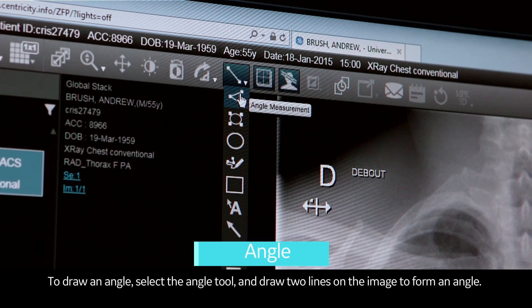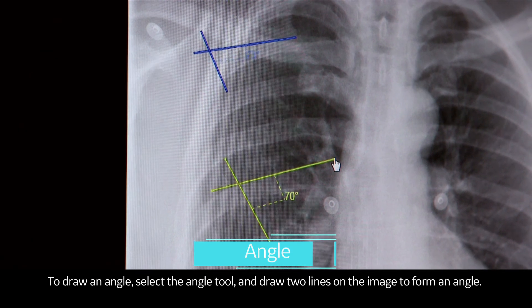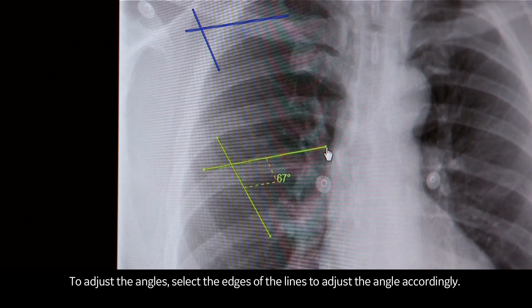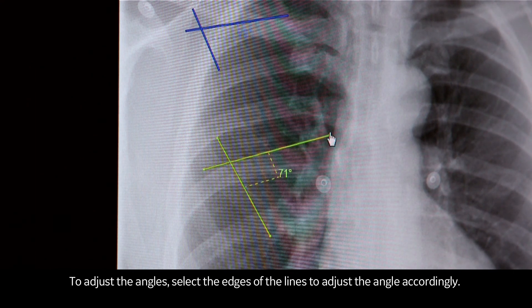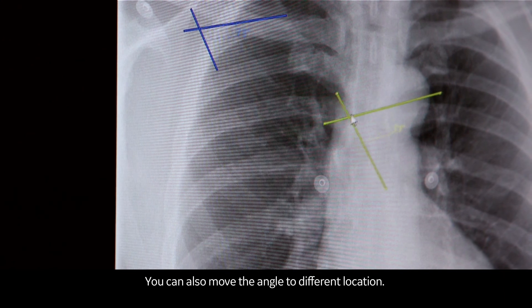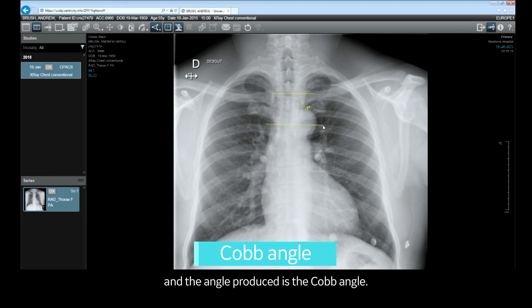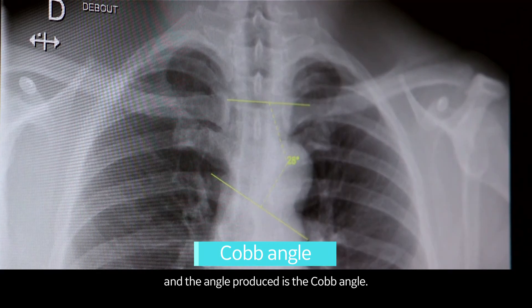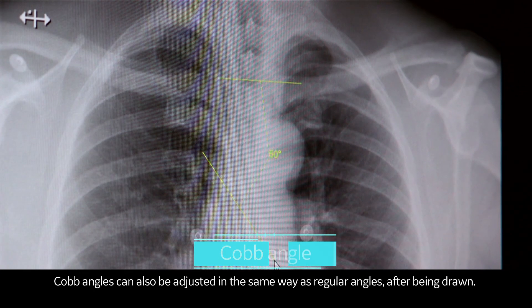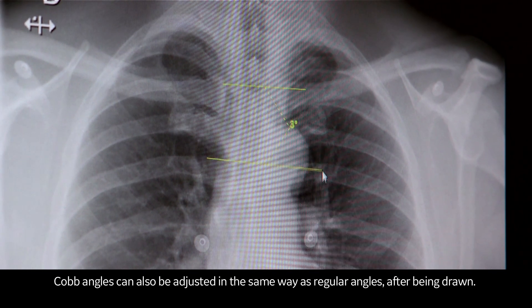To draw an angle, select the angle tool and draw two lines on the image to form an angle. To adjust the angles, select the edges of the lines to adjust the angle accordingly. You can also move the angle to a different location. To measure a Cobb angle, draw the two lines at the relevant levels and the angle produced is the Cobb angle. Cobb angles can also be adjusted in the same way as regular angles after being drawn.